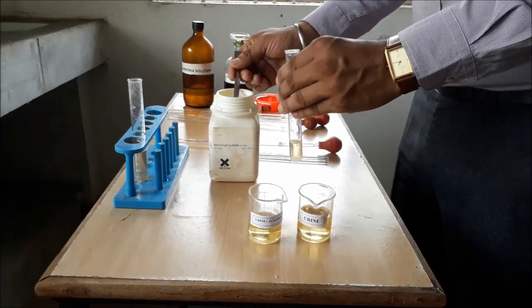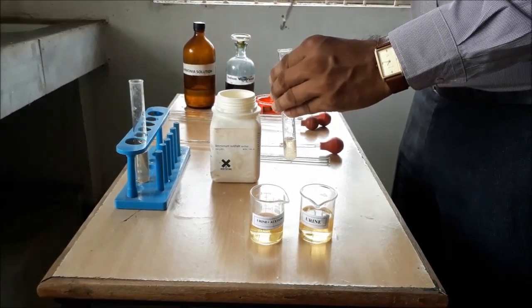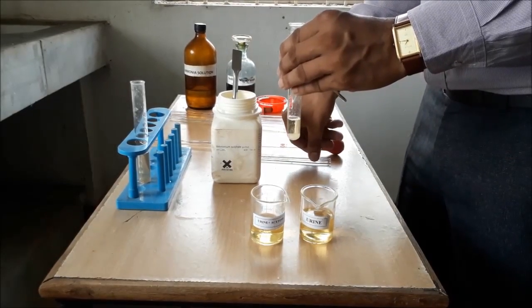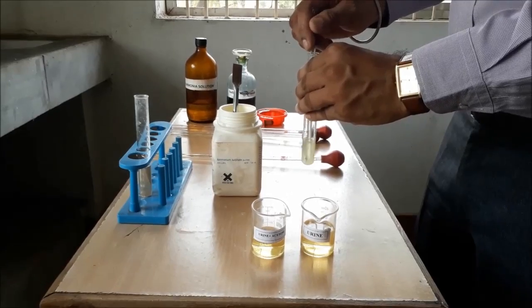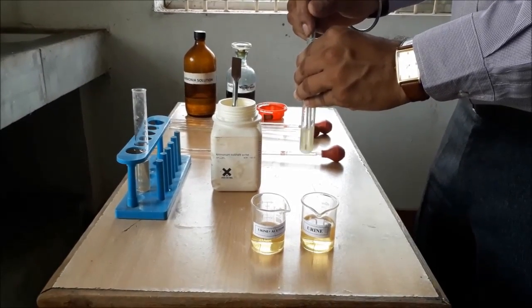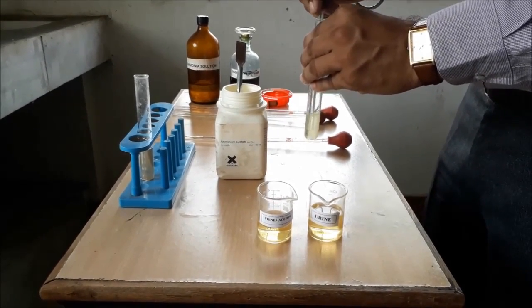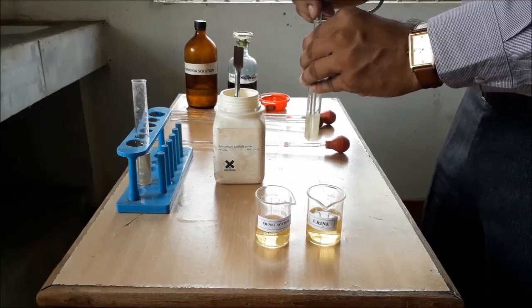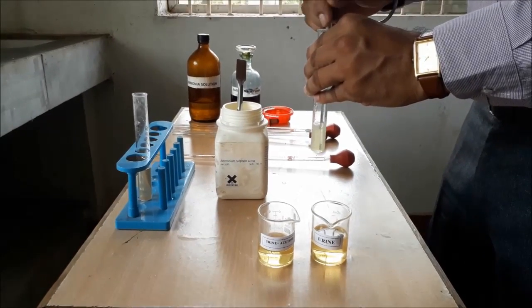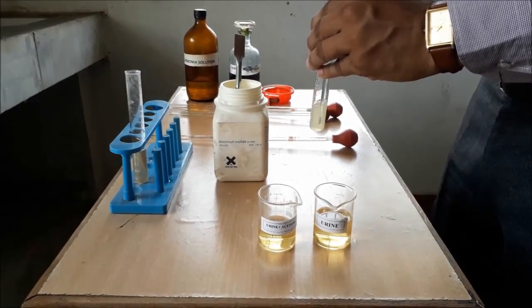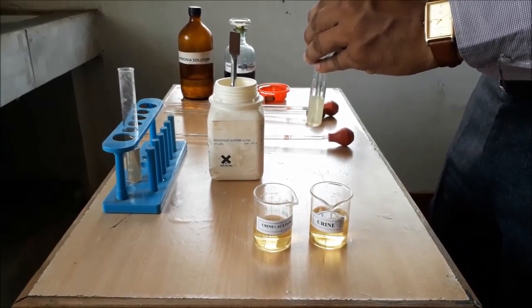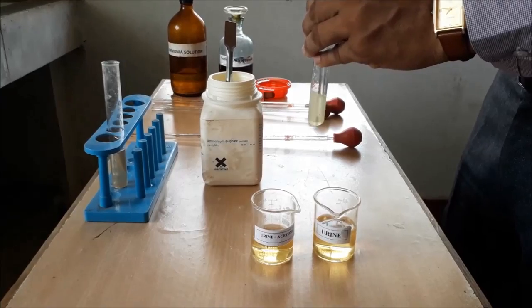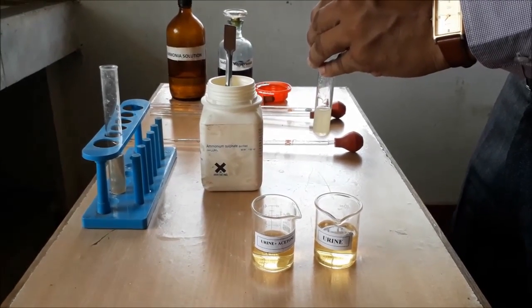After transferring it into the test tube, add ammonium sulphate slowly to the test tube and start dissolving it with the help of glass rod. We have to dissolve the ammonium sulphate till a saturated solution is achieved, means we have to add spatula of ammonium sulphate to the test tube having urine sample till it stops to dissolve.